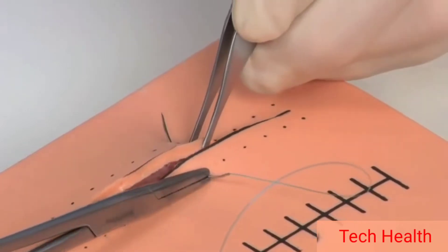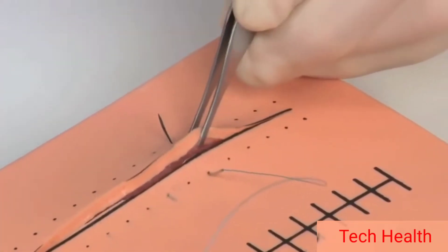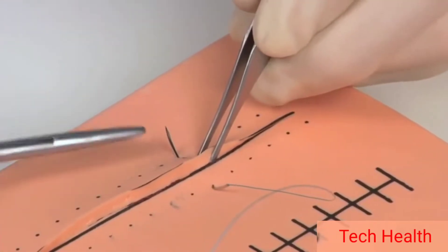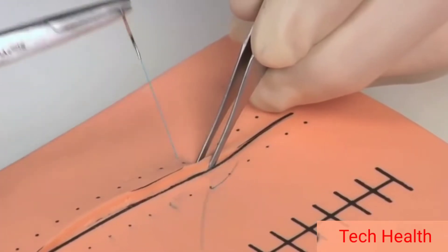Engage this side at a perpendicular angle. Hold on to the skin with forceps. Rotate on through, leaving about five centimeters.